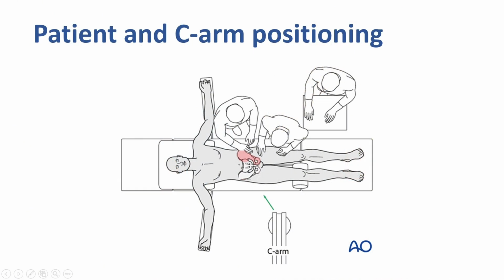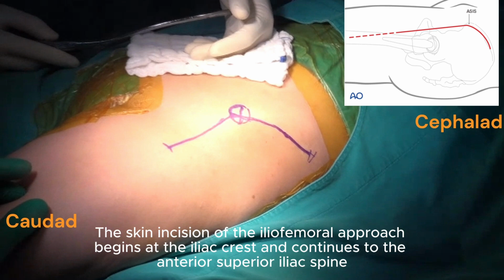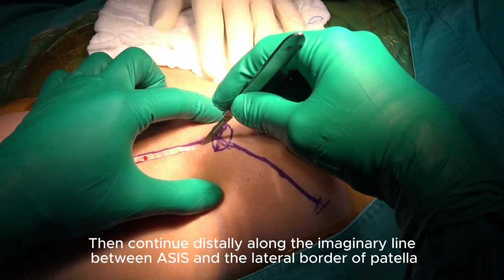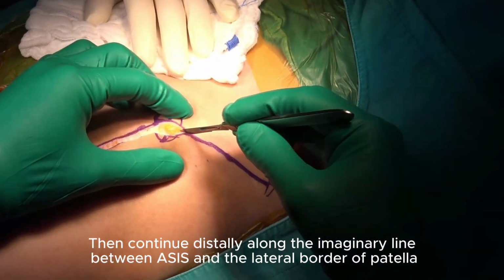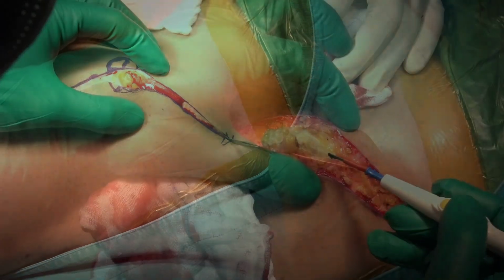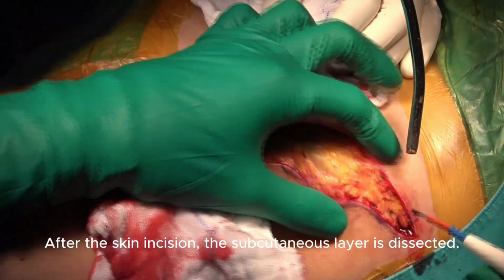The surgeon operates on the same side of the fracture, and the image intensifier comes from the opposite side. The skin incision of the iliofemoral approach begins at the iliac crest and continues to the anterior superior iliac spine. Then continue distally along the imaginary line between ASIS and the lateral border of the patella. After the skin incision, the subcutaneous layer is dissected.